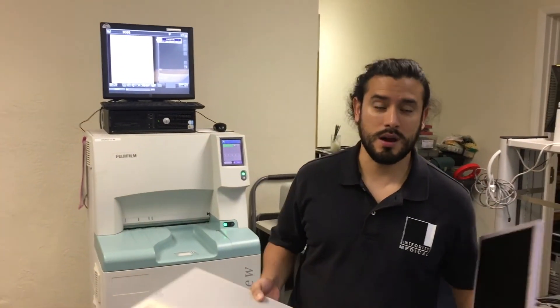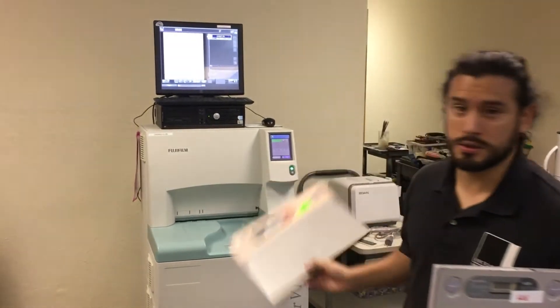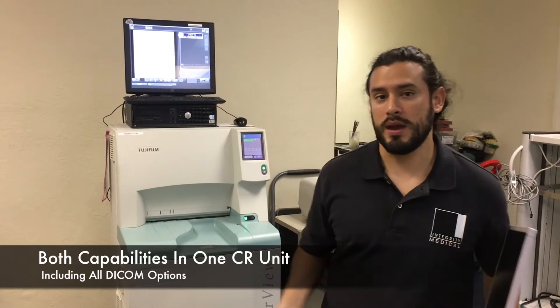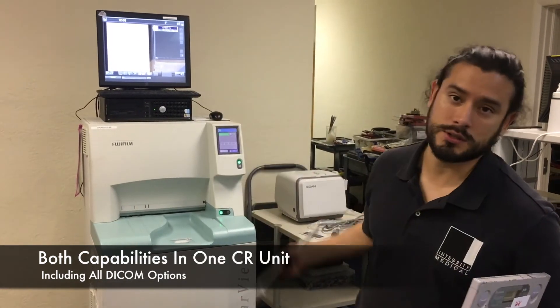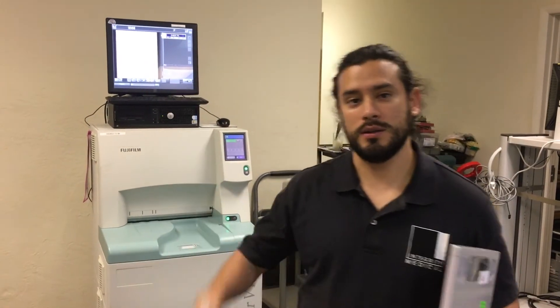If your needs are mammography and radiographic, you can accomplish that with just one unit. This will also include the DICOM packages, worklist, and DICOM storage. It's a very versatile unit. You can get one at Integrity Medical.